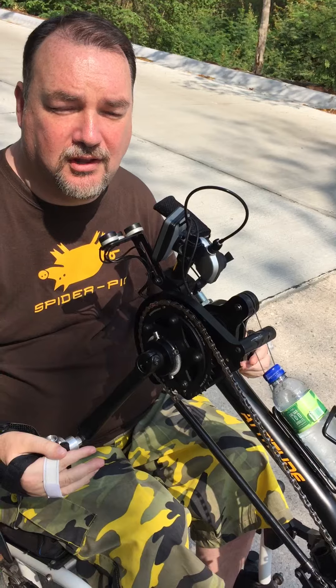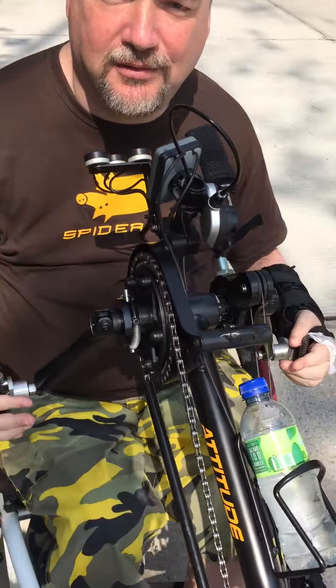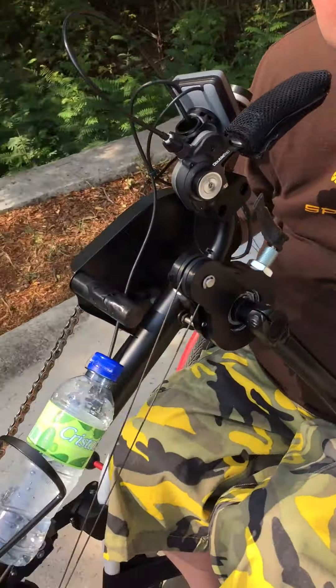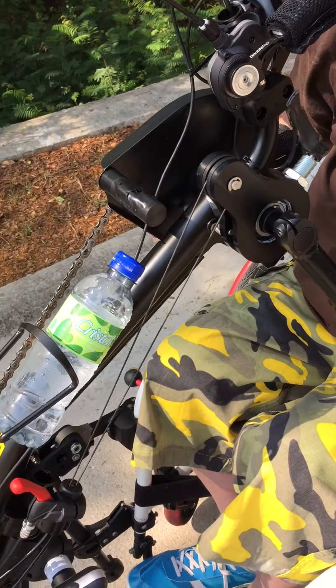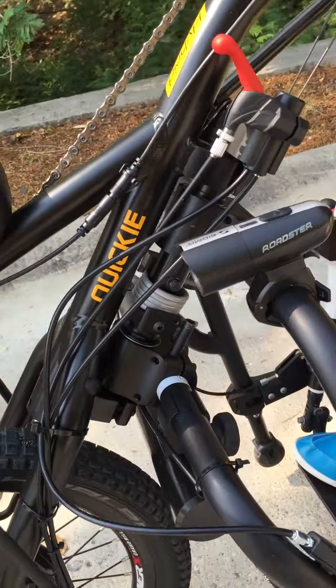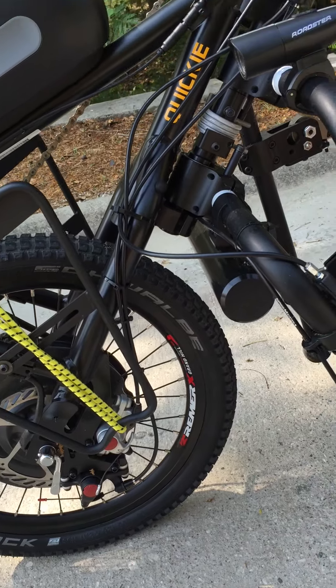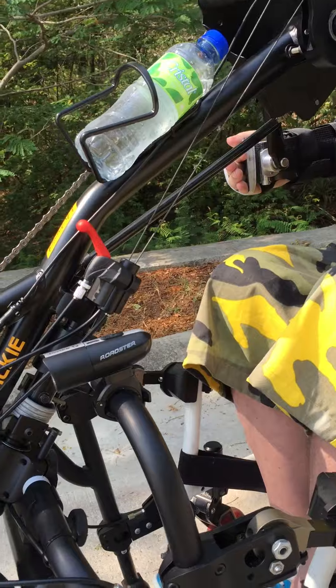We've done a modification on the bike whereby we've taken the handbrake off, and instead of using the handbrake and the pedal backbrake separately, we've used both brakes on the pedal backbrake. So they're both working together, which gives a much stronger braking performance and it's much easier to engage the brake as well.